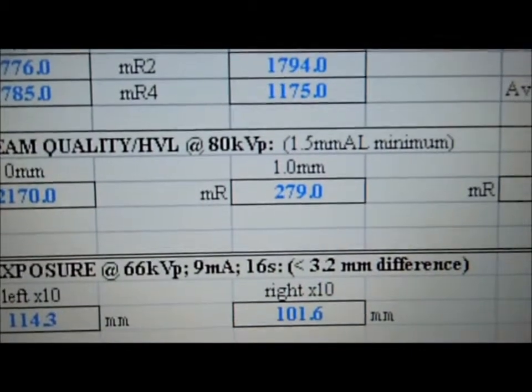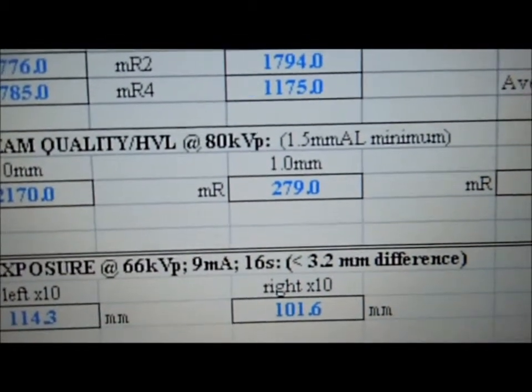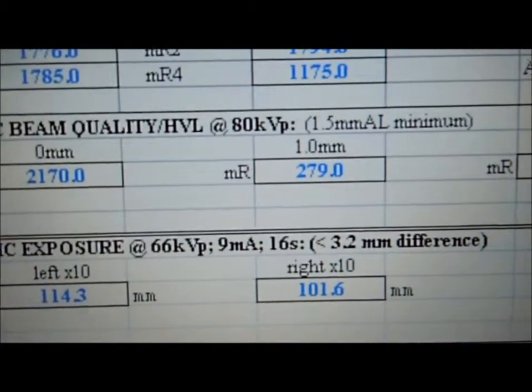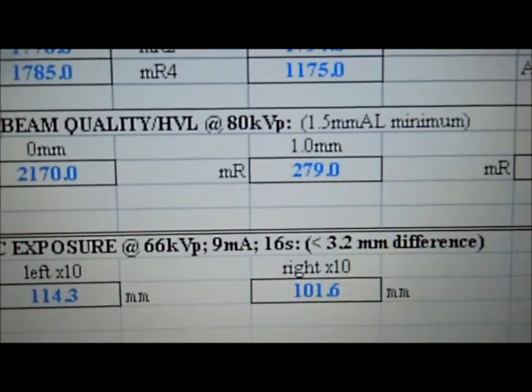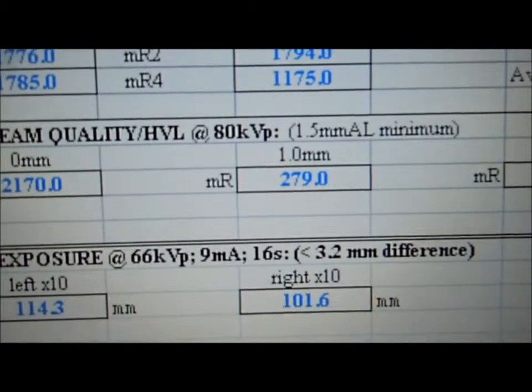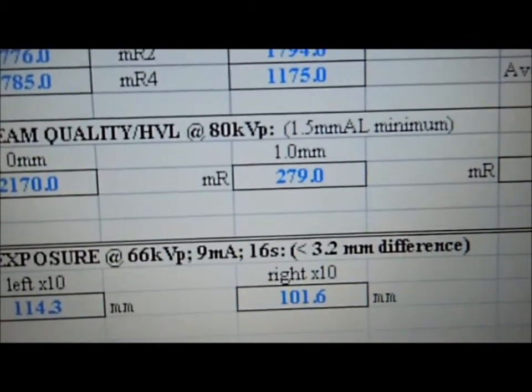Half-value layer provides important information about the radiation energy characteristics of the X-ray beam. Basically, if the half-value layer for the X-ray beam is low or thin, then the X-ray beam contains more low energy and less penetrating radiation. If the half-value layer is high or thick, the X-ray beam contains more high energy or high penetration energy. This is important because X-rays used for correct patient diagnosis must have enough radiation to penetrate the desired body part and effectively expose the image of the patient on the film.